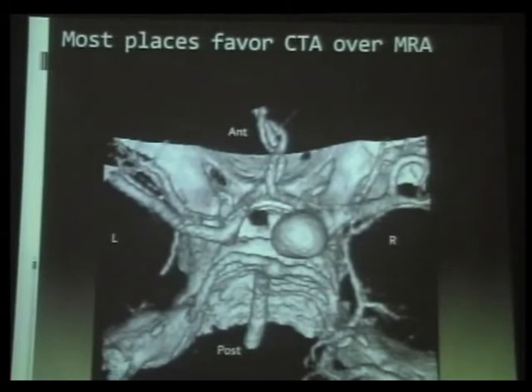enough. If, however, you still think they have an aneurysm, or your CTA is not very good, or doesn't show the skull base, or has artifact, or they can't rotate this image around and show you the posterior communicating artery, then you are stuck with catheter angiogram for that person. So again, pre-test likelihood of disease is much more powerful than the test.